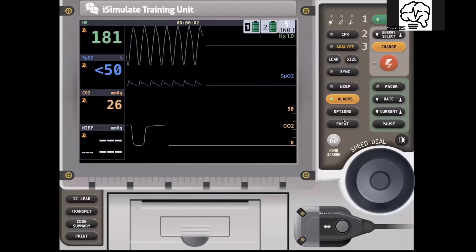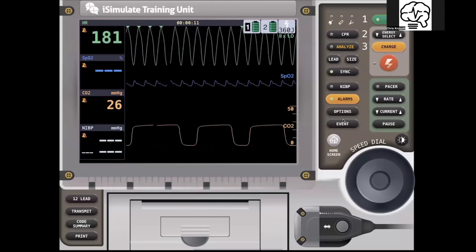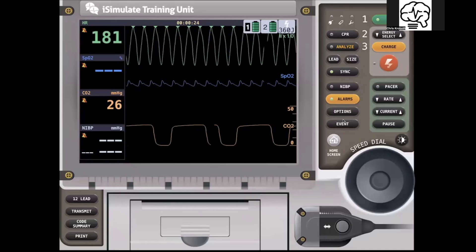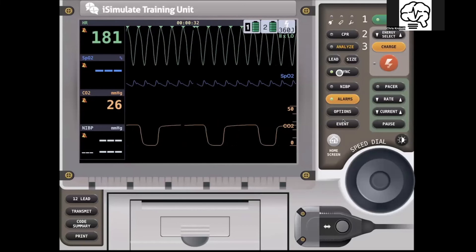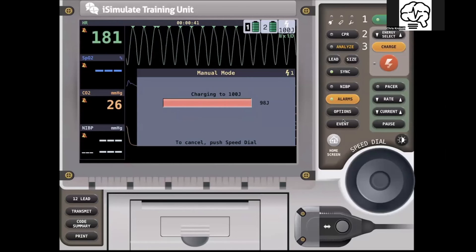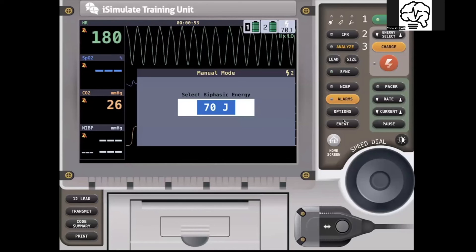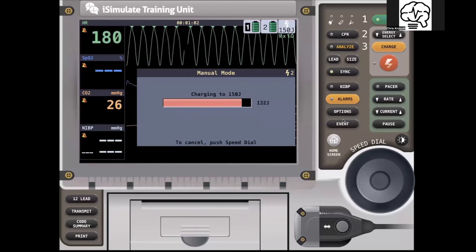What would that look like on the LifePack 15? We need to hit sync. The reason I like what the 35 has over this is sync is in your face — it's part of the therapy tab, and you have to make the decision to hit it. Here, sync is going with the little markers at the top, but it's just a green light in a sea of a lot of other things going on. I pick my energy, charge it up — clear, I'm clear, we're all clear — shock, delivered. They're still in V-tach with a pulse. I need to charge up — and I've got to hit sync again. It's not in your face like on the 35, and it's something that can easily be missed in a high-stress situation.